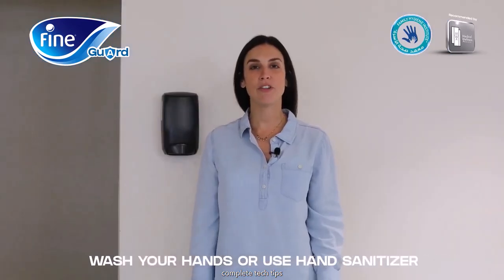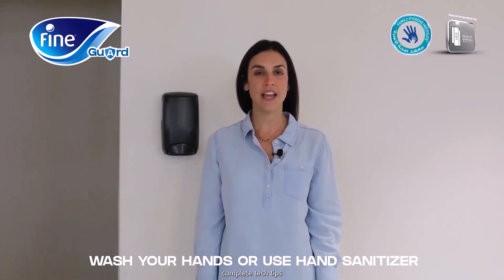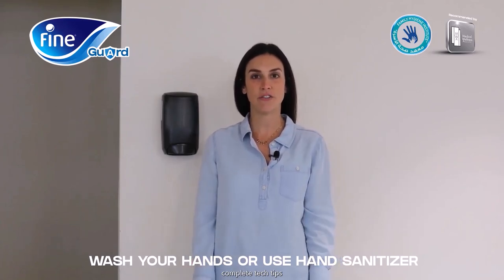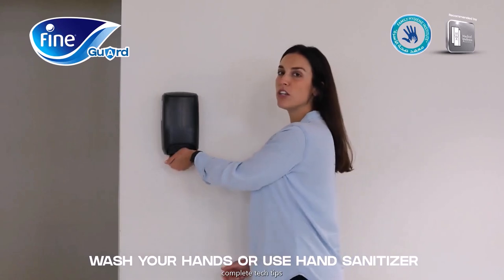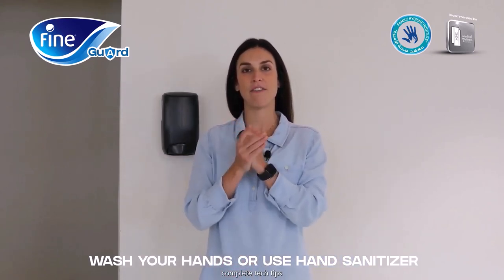The first step when you have your FineGuard face mask is to make sure to wash your hands or use hand sanitizer before placing it on your face. I'm just going to use some hand sanitizer and rub it all on my hands before placing on my face mask.